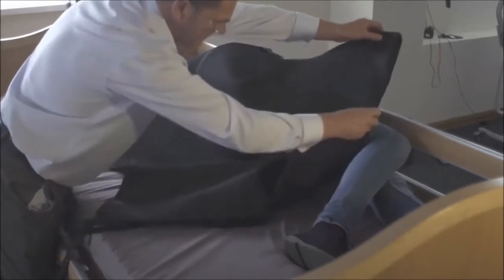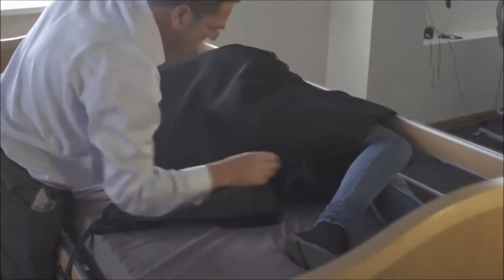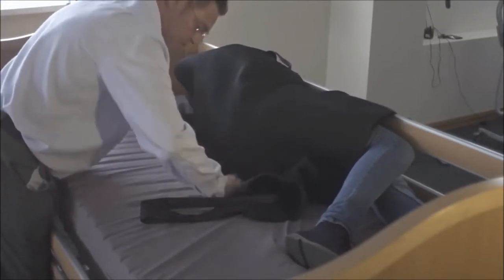Just lie this sling over. Okay, making sure we've got that down the back of the leg. Middle of your aperture, tuck in the remainder of the sling under. Keep it as flat as we can.